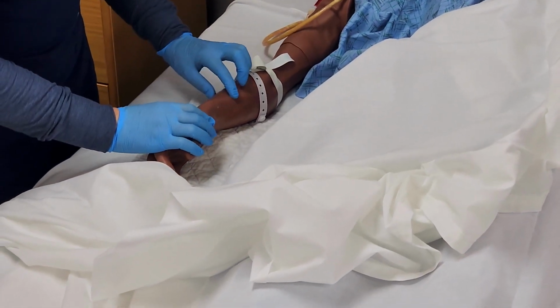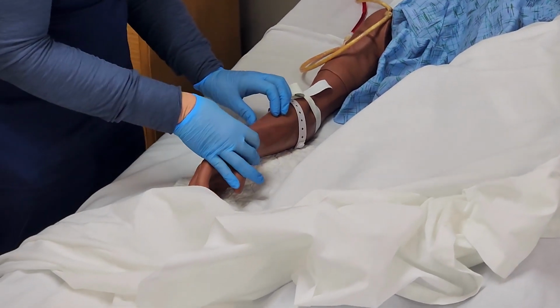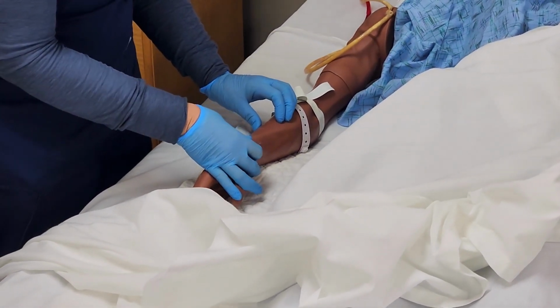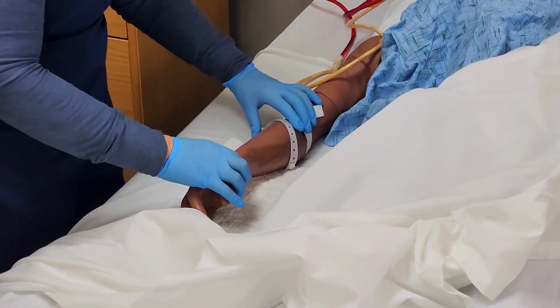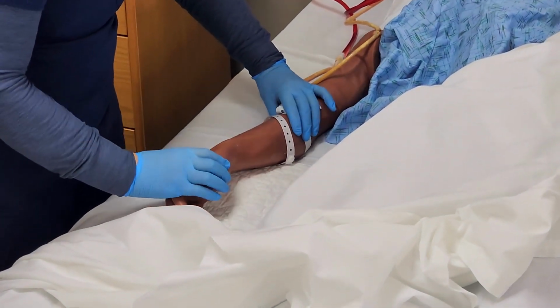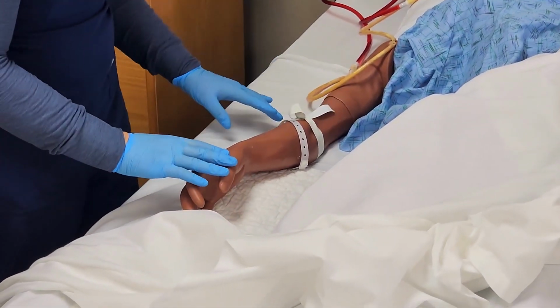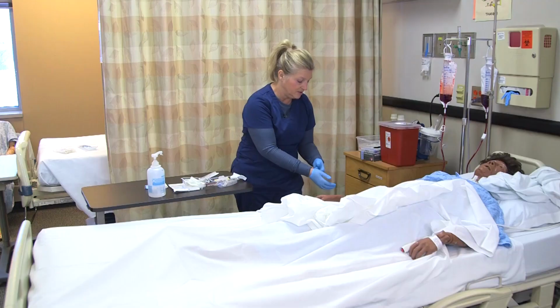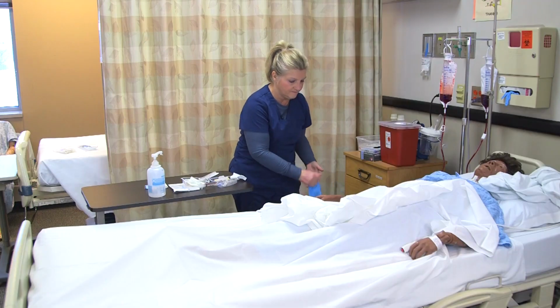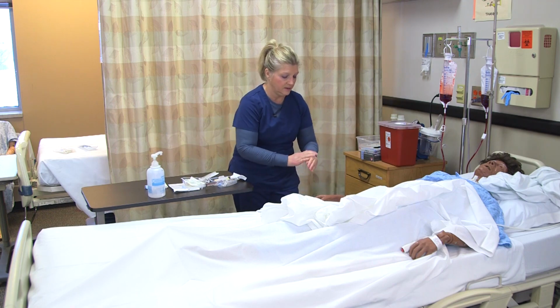And this vein feels really well. It's soft, it's flexible, it's bouncy. When I pull down on it, I don't feel any valves in this area, and I don't see any valves in that area. So I'm going to kind of put this patient's arm in sort of a dependent position, and then I'm going to go ahead and release the tourniquet, and I'm going to remove my gloves and wash my hands, and I'm ready to cleanse the site.